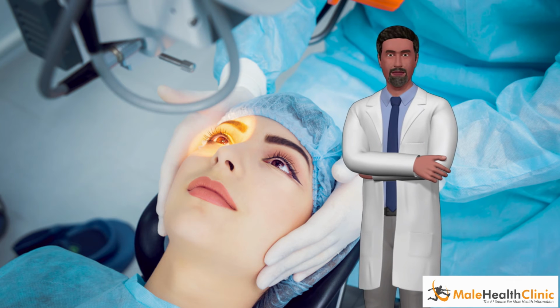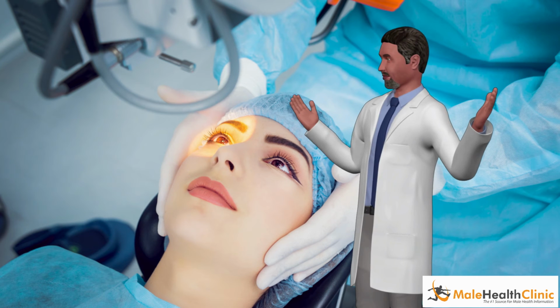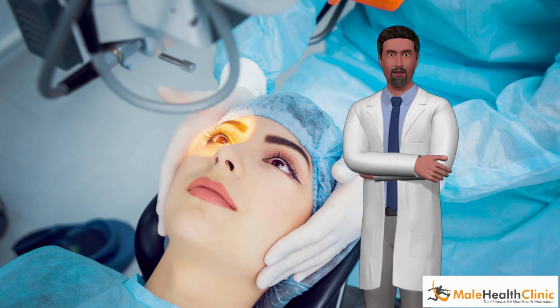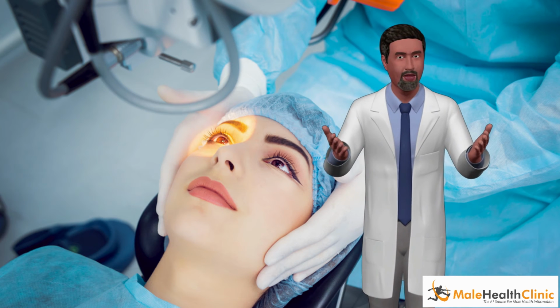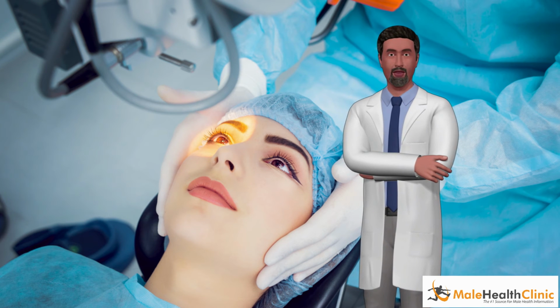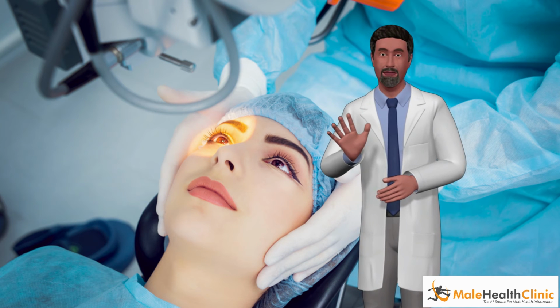More severe refractive errors will require longer laser treatments since more corneal tissue will need to be removed. As the laser pulses a beam of light into the eye to remove the excess tissue from the eye, the patient will hear a ticking or zapping sound and may smell an odor similar to that of burning hair. Once the laser has ceased pulsing, the surgeon will replace the corneal flap on the eye and smooth it out to ensure no surface wrinkles develop.